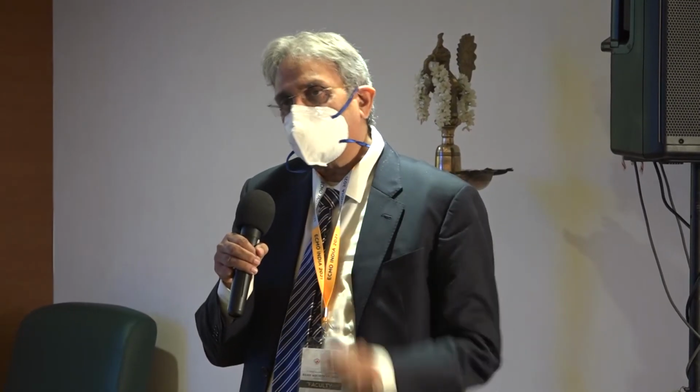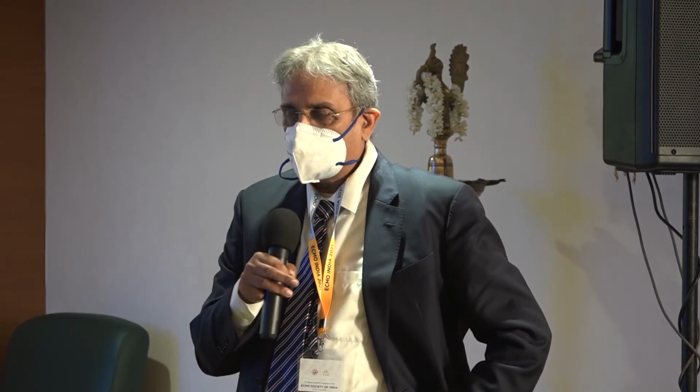So a nurse or a duty doctor is massaging, and the rapidest way of getting ECPR in children is to cannulate the neck. You make a slash just above the clavicle. In literally 30 seconds, you can loop the carotid artery and vein, and you shove it in. And children tolerate ischemia for a longer time. So we've had 2 instances where up to 1 hour of cardiac massage, those children completely woke up.